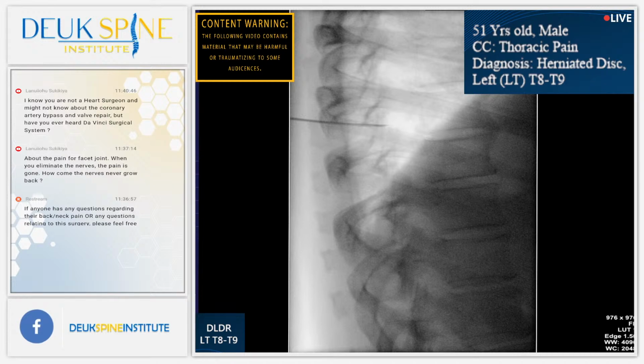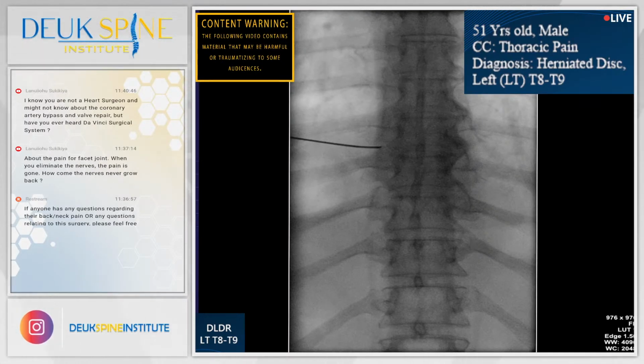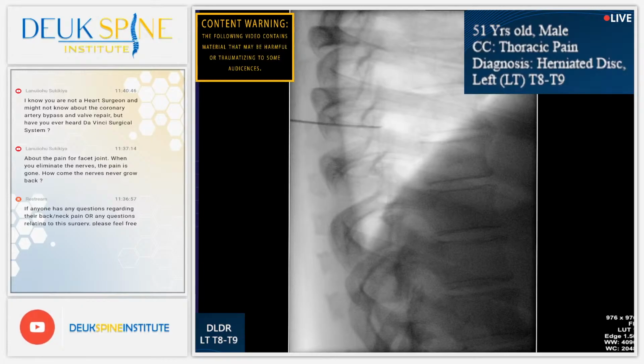AP. I'm being forced superior. Twelve, 11, 10, 9, 8. I just seem to be getting forced superiorly.